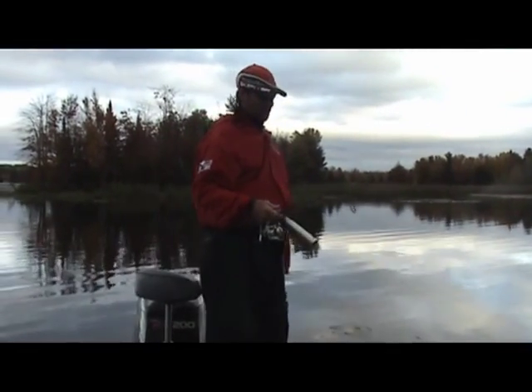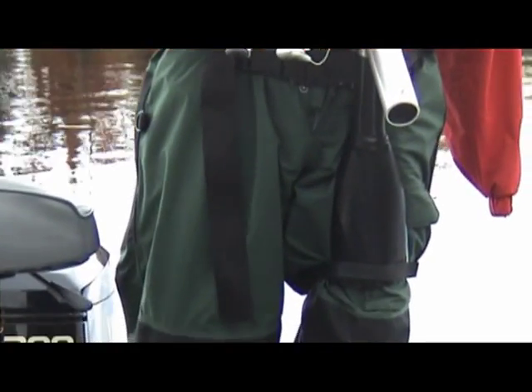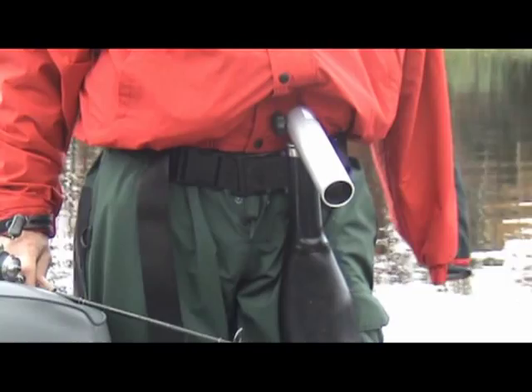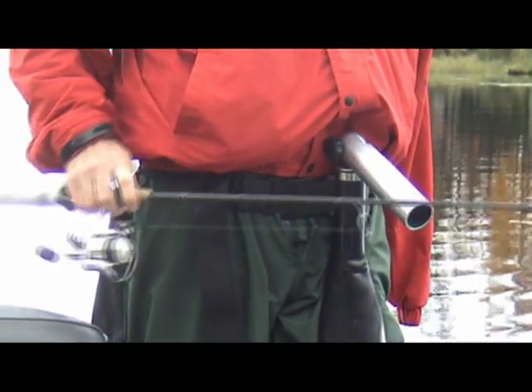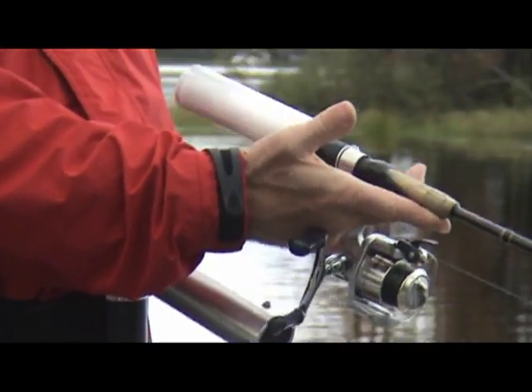We'll look at the apparatus itself. You can kind of see it's around your thigh, with a waist buckle and a support, and then the rod holder which is keyed. And then the rod handle — the rod itself has to be kind of customized too.